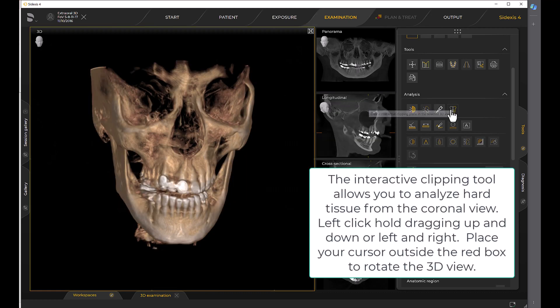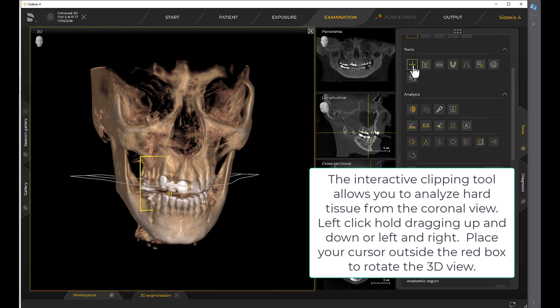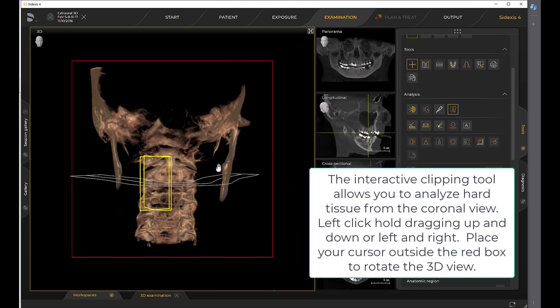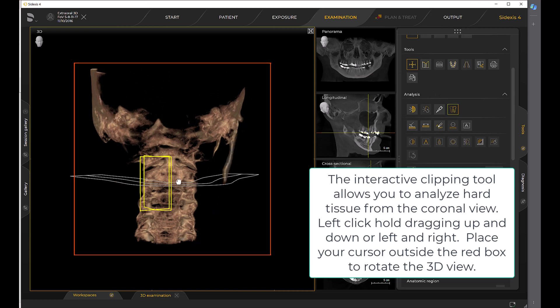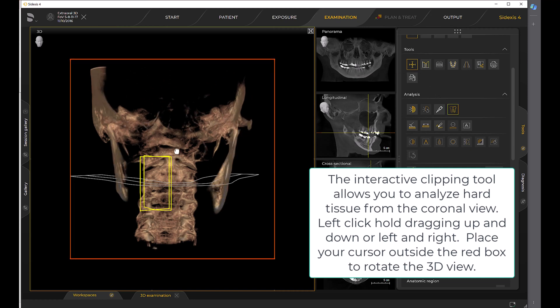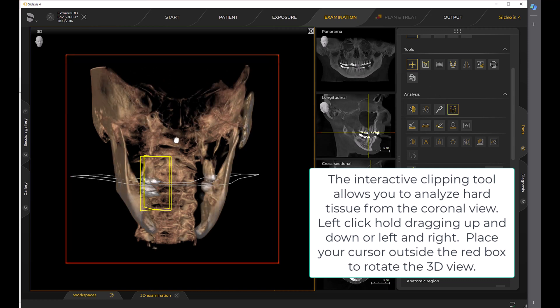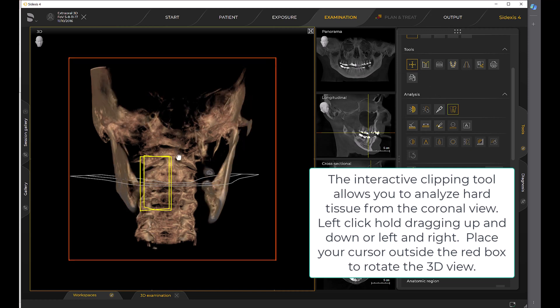The interactive clipping tool allows you to analyze hard tissue from the coronal view. Left-click hold, dragging up and down or left and right. Place your cursor outside the red box to rotate the 3D view.